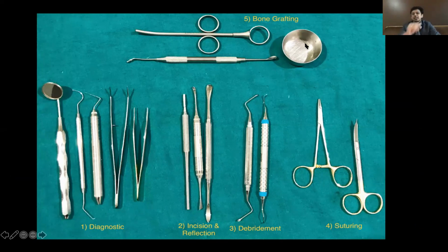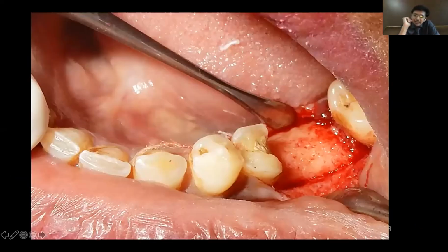So now you have raised the flap. So again, with regard to reflection of the flap, especially in cases of delayed implant cases, do we have any choice with regard to the incision, type of incision?